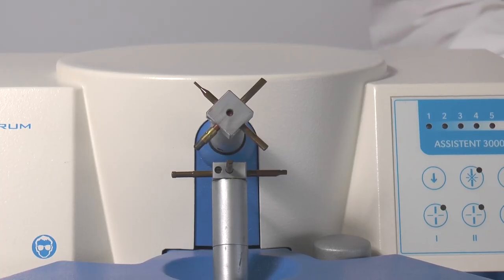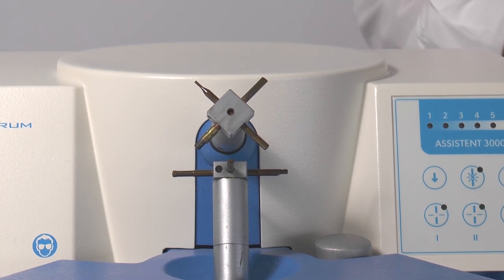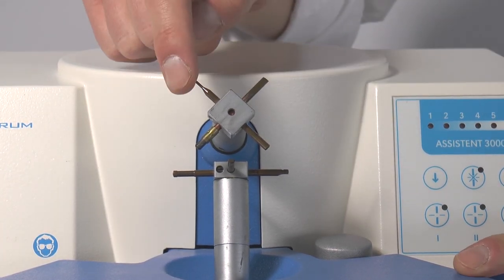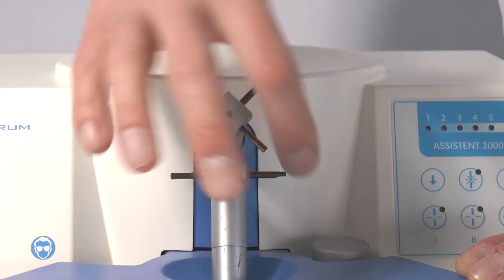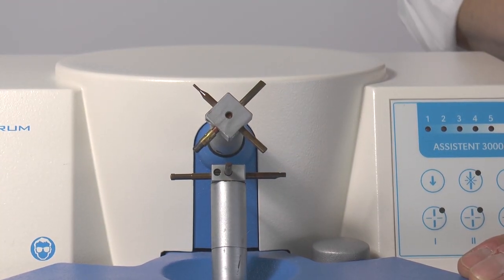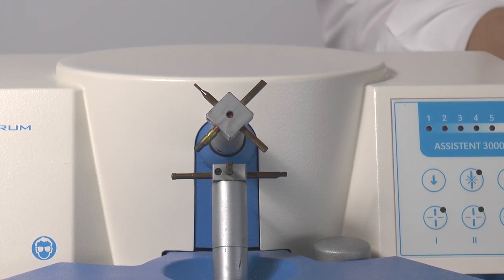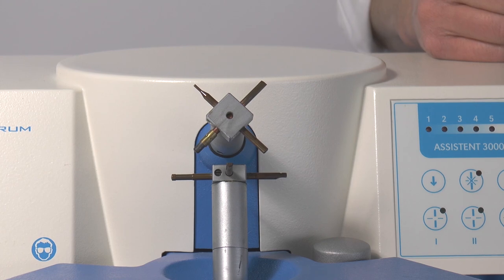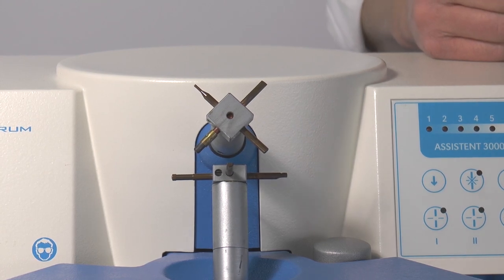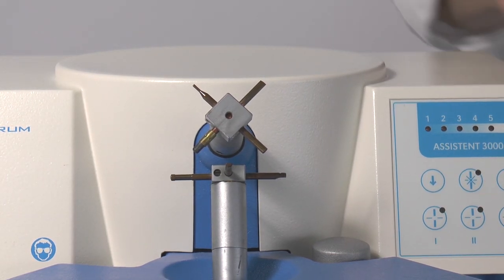Now the choice of the electrodes. For spot welding on the unit you can choose among three copper electrodes on the upper side and four on the lower. Use the combination that fits the workpiece — for example, a small attachment needs a small electrode, and a wire sometimes needs a groove in the electrode. For soldering you always need a carbon electrode, so this can be a combination for soldering.